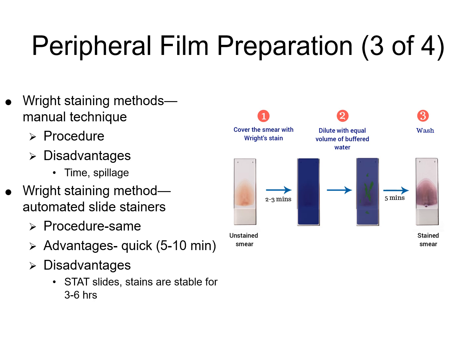That's the typical procedure. Some disadvantages: it's time consuming, requiring about 10 to 15 minutes of hands-on time. There's a risk of spillage or inconsistent staining if timing or technique is not carefully followed. And there's also variability due to manual handling, which may affect reproducibility.